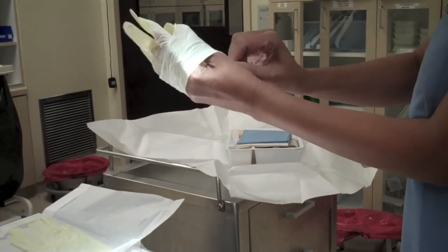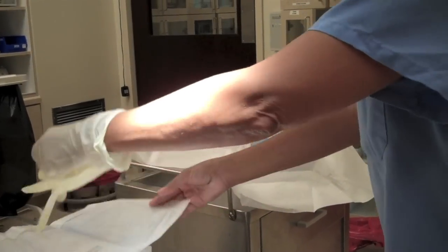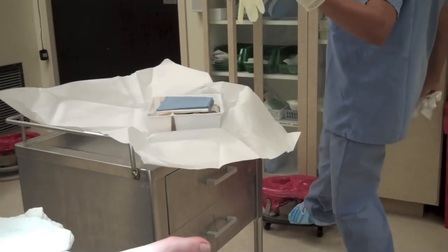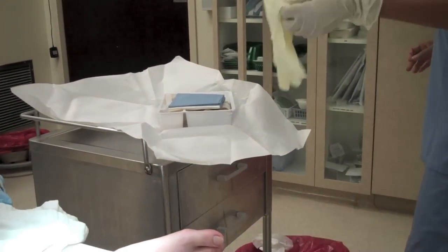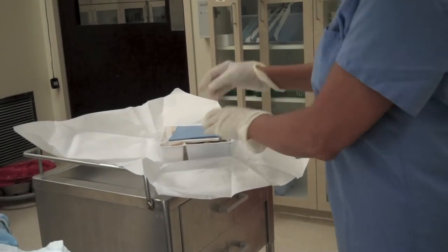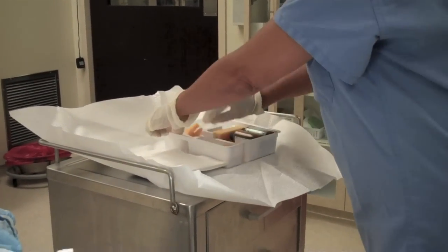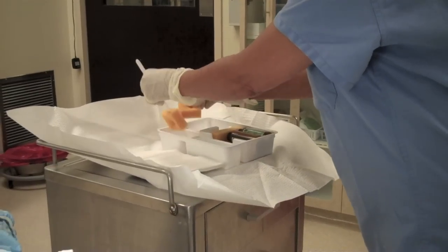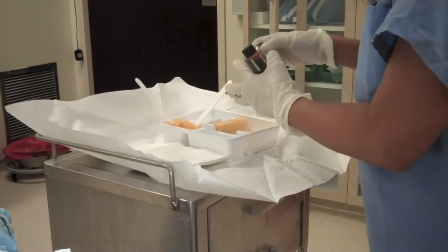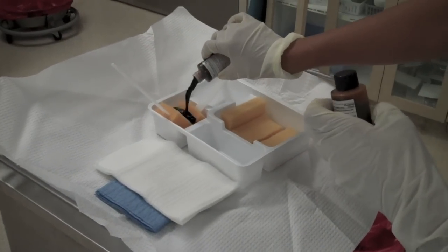I'm putting on sterile gloves to do this procedure. Our little patient is asleep.